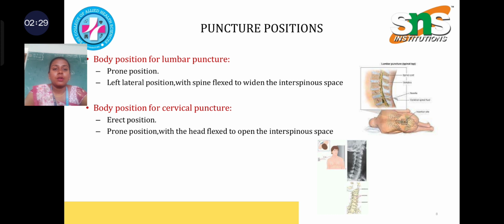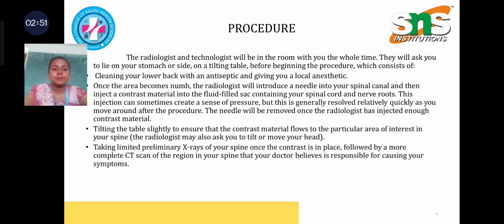Puncture position: body position for lumbar puncture, prone position, left lateral position with spine flexed to widen the interspinous space. Body position for cervical puncture, erect position, prone position with head flexed to open the interspinous space.